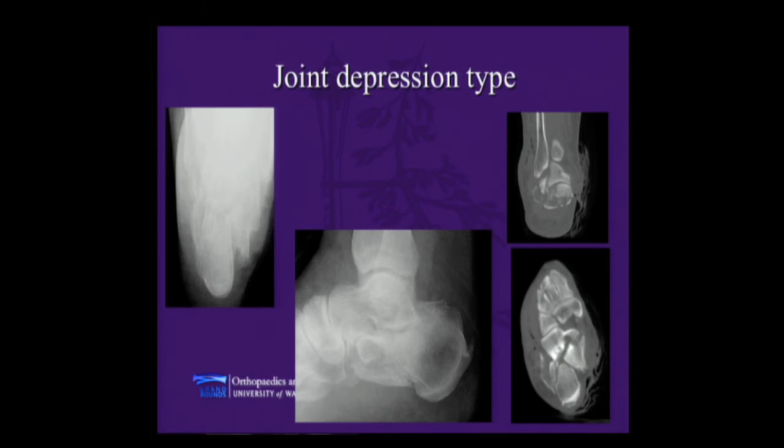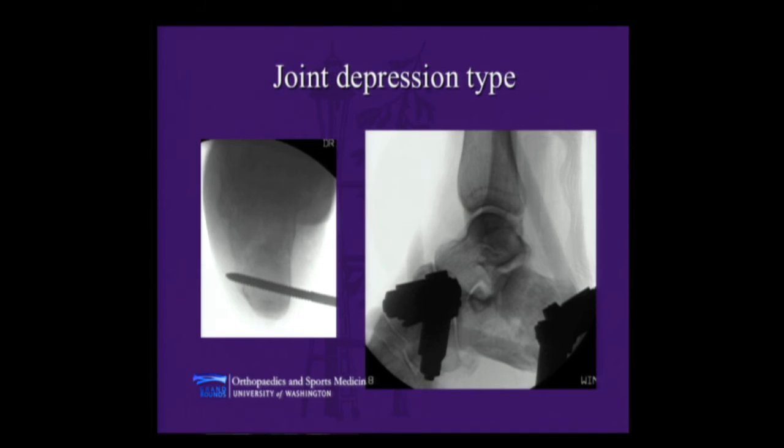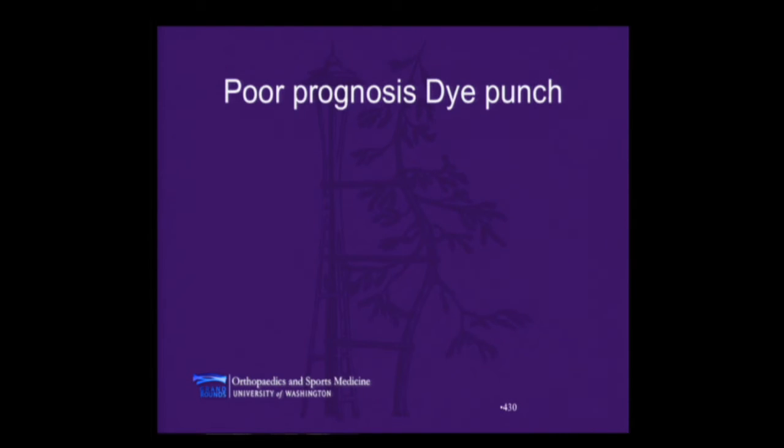This is one of Bob Dunbar's patients he was on call, brought this patient in, washed him out, got a nice fixator, got an excellent reduction just with the fixator, and this got most of the pieces back except for the fracture in the middle facet, which we were then able to elevate at the time of insertion of the screws and wires. This is a 78-year-old patient with a poor soft tissue envelope that was open medially. This is her after the operation. This is her at 1 year back to relatively normal function with pretty good movement.